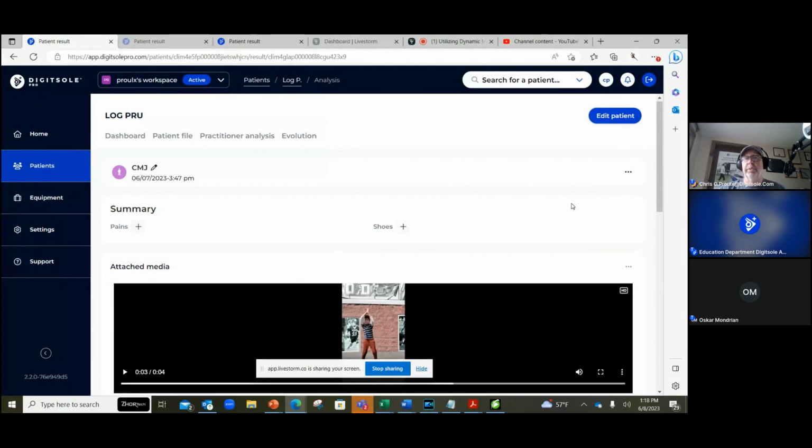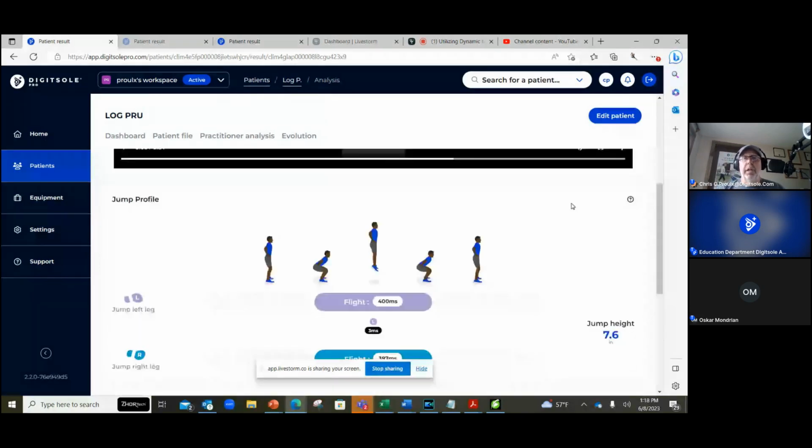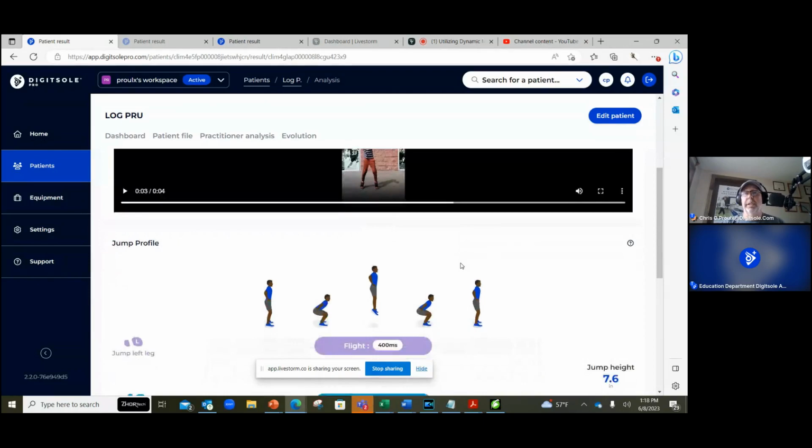in your systems, on the mobile device, you'll have a few different options, and because the video is not a requirement, you can decide whether or not to use it. So, for example, I don't typically use it in the 30-second unless I'm inside and I have a really good strong Wi-Fi connection because it is a little bit data heavy, and that's kind of important. And you don't want to have an error and then miss out on the entire test.